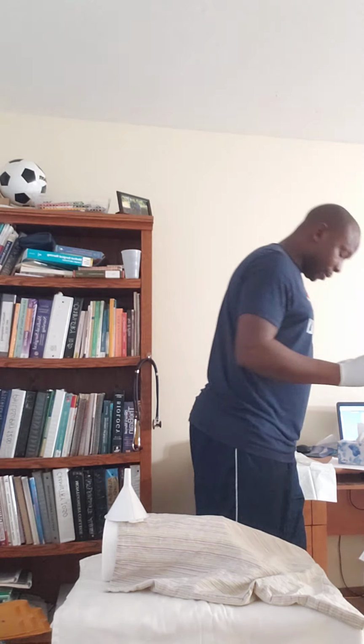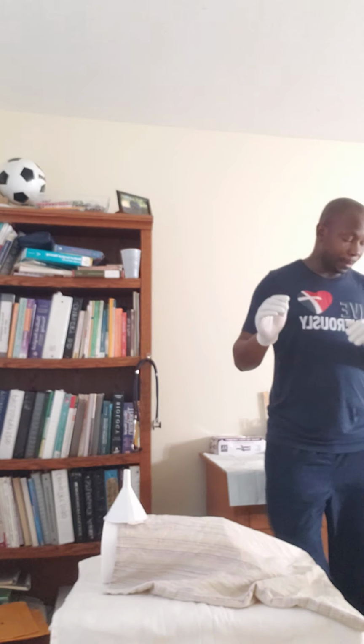I'm going to make sure the suction pressure is 120 millimeters of mercury. That is going to help keep the patient from suffocating. From there, I'm going with my hands up.